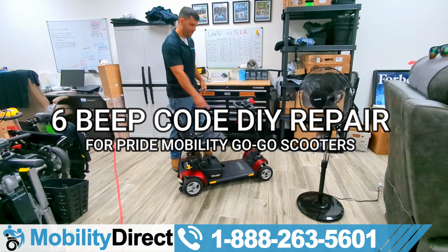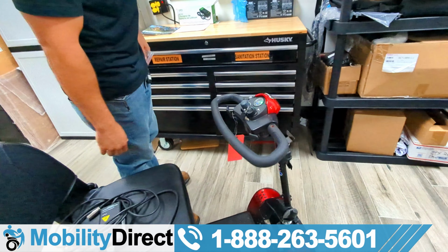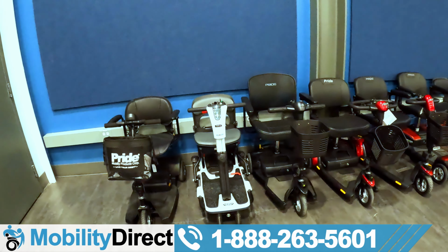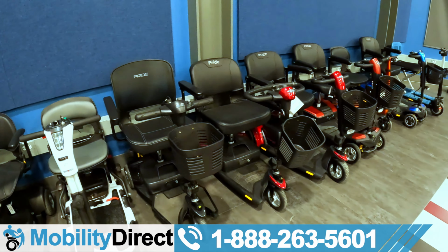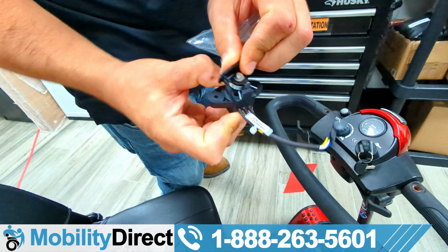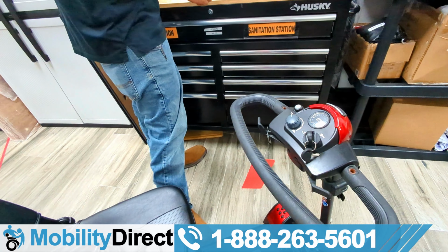Thanks for stopping by. In today's video, we're going to talk about a 6-beep code repair. And this repair is going to indicate that your throttle potentiometer has gone bad. Any mobility scooter by Pride Mobility that has the same throttle that you're seeing here on the screen is going to work the same way. So you can follow along with this video if you want to save some money and replace your throttle potentiometer on your own.